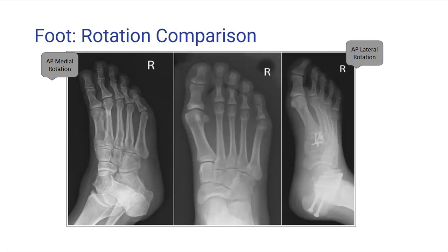To avoid these errors, you want to ensure that the foot is properly aligned for the AP axial projection, whether it's weight-bearing or non-weight-bearing. You want to take care to prevent any medial or lateral foot rotation. This alignment allows for clear and accurate imaging.